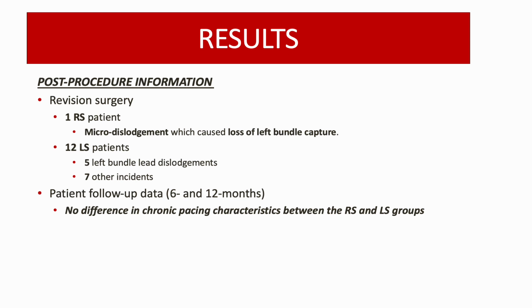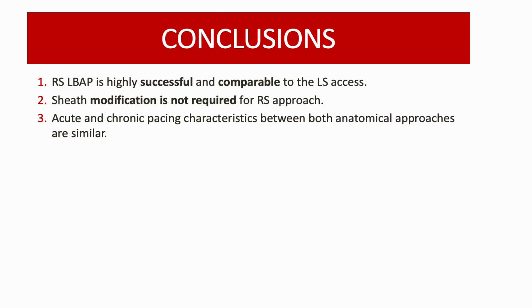Overall, the follow-up data had no differences, which confirmed that both approaches had the same pacing success and had very low lead complications that followed the initial procedure. In conclusion, the right-sided approach to left bundle area pacing procedures is highly successful and comparable to the left-sided approach. There was no sheath modification that was necessary for the right-sided approach, and acute and chronic pacing characteristics between both anatomical approaches were similar.